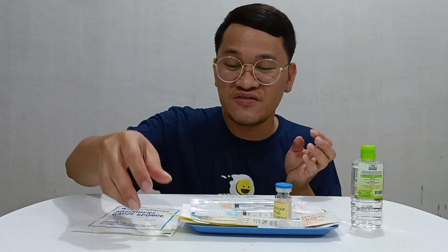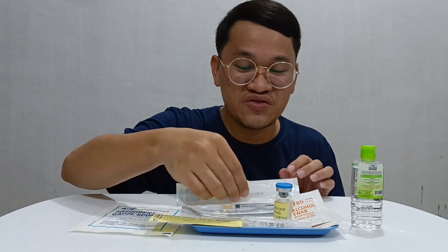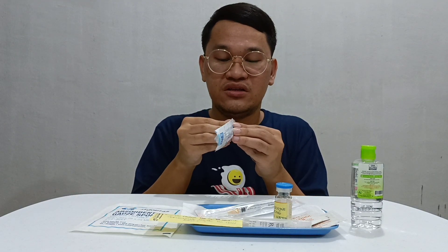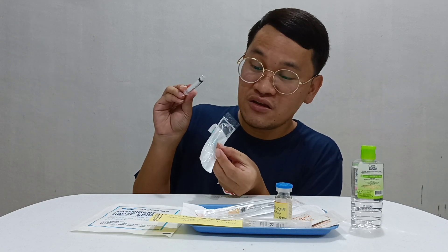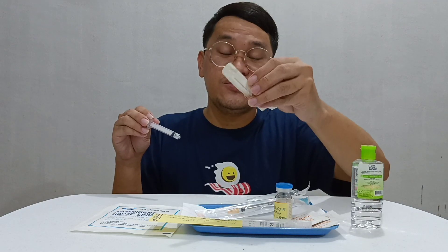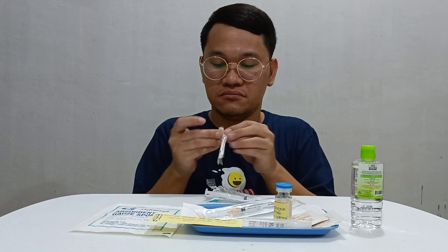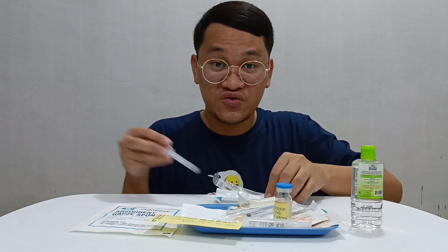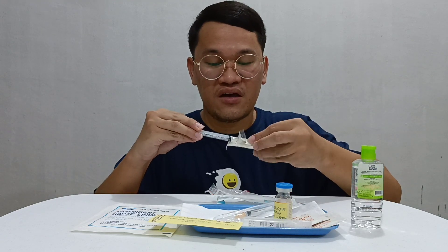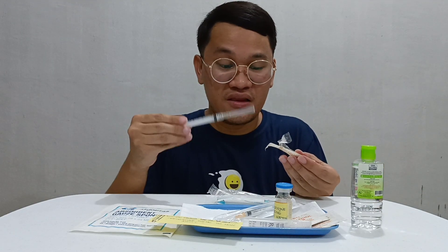Before I give an intramuscular injection as ordered by the doctor, I will be needing to do the skin testing first. To do that, I need to dilute the antibiotic. I will use my 3 ml syringe to dilute. I need to change the needle from the administering needle to the aspirating needle. I opened my aspirating needle, which will be attached to my 3 ml syringe. It's already locked.